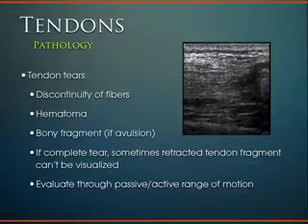When any tissue in the body tears, it's going to bleed, so you're going to see that hematoma, local fluid collection. Fluid basically is anechoic or basically no signal, it's black. And so you're going to see this anechoic area or black or fluid collection within the tendon architecture with tearing in the tendon itself. And then again, it's very dynamic, and so it's pretty neat.